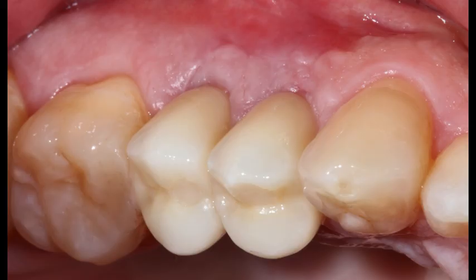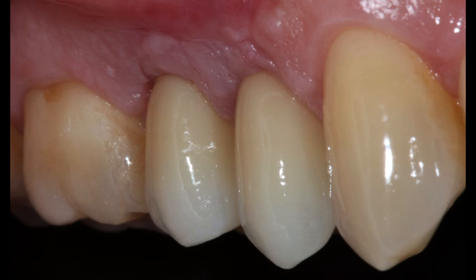And this is what allows you to finish up with this beautiful natural contour, as you can see, not ruining all the buccal convexity that he initially had. And despite at the beginning he had some recession on the bicuspids, you could finish with this beautiful contour with the final crowns on.